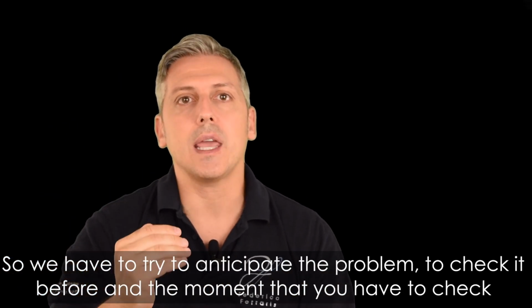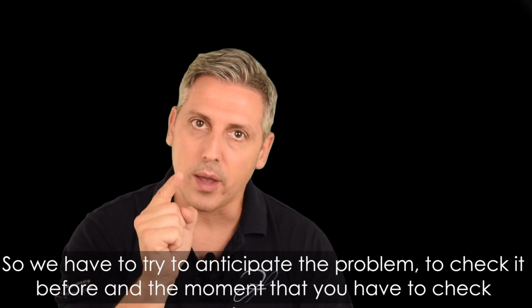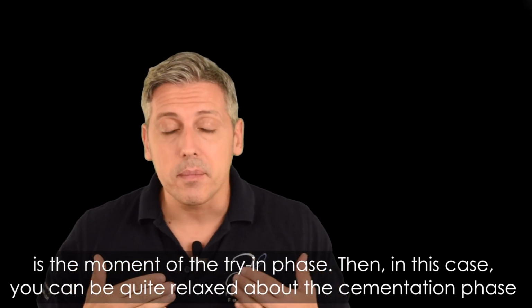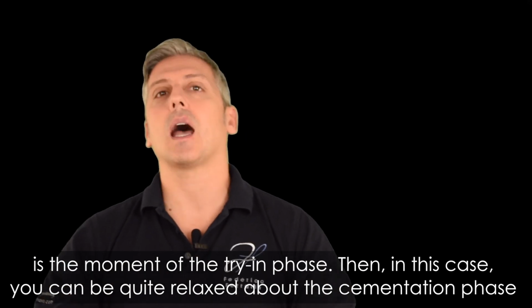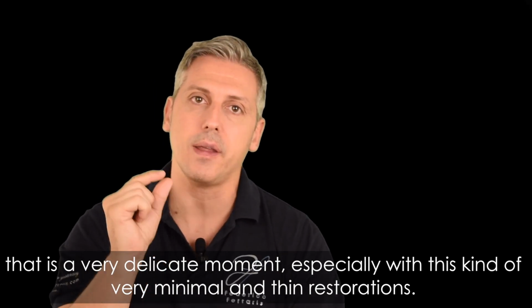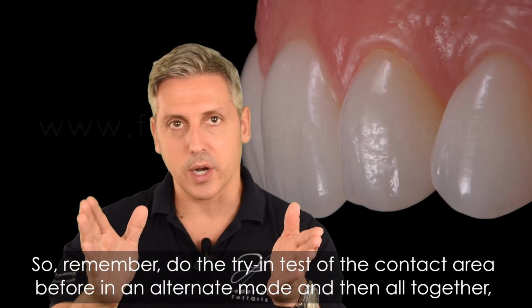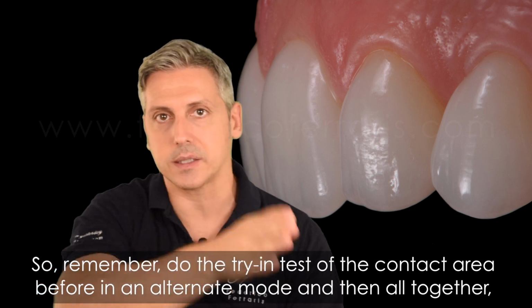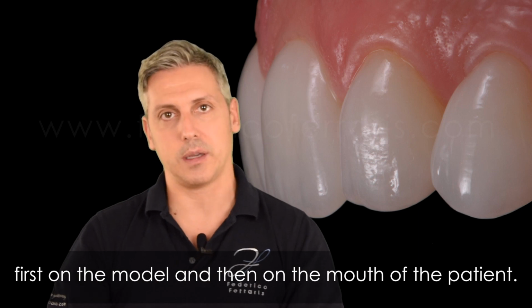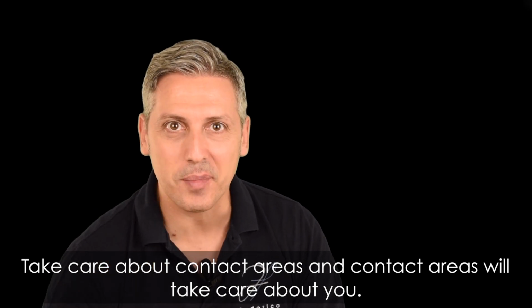So we have to try to anticipate the problem and check it before, and the moment to check is the try-in phase. Then you can be quite relaxed about the cementation phase, which is a very delicate moment, especially with this kind of very minimal and thin restoration. So remember, do the try-in test of the contact area beforehand, in alternate mode and then all together, first on the model, then in the mouth of the patient. Take care of contact areas, and contact areas will take care of you.